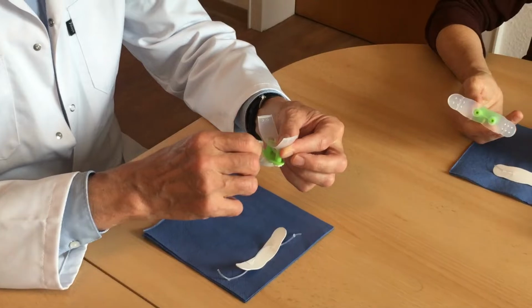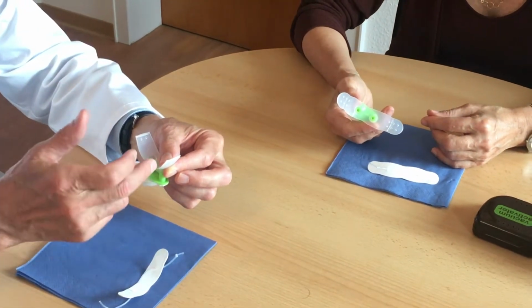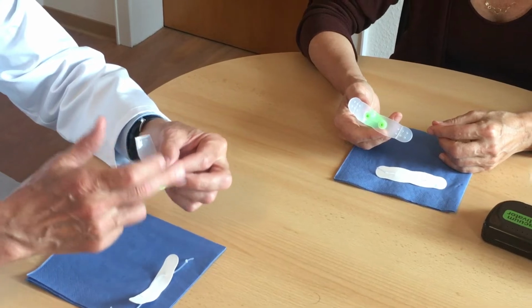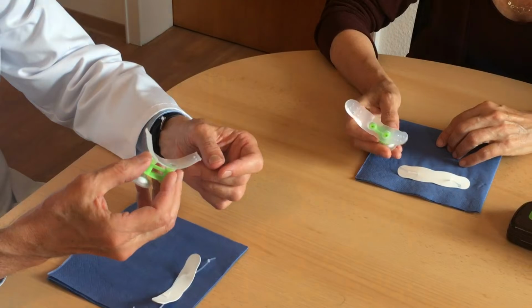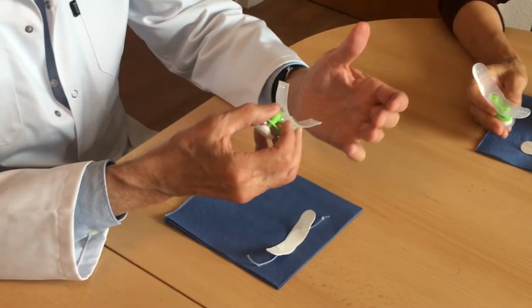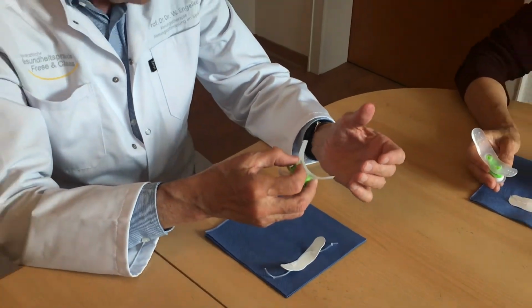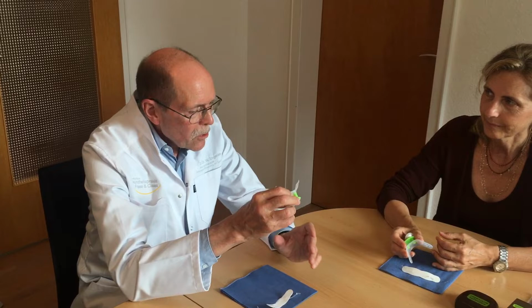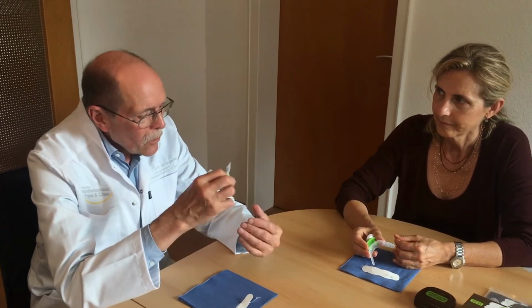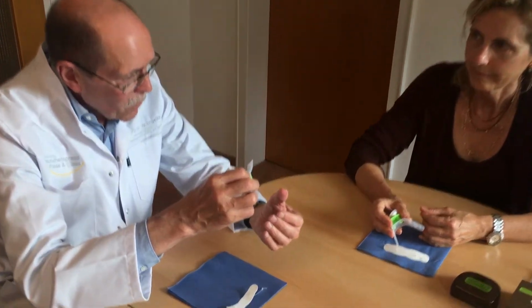This depends on the anatomy. The majority of people use the shortened form. If the shortened membrane is used, the production of saliva is significantly reduced. So we may use the vacuum activator to show if the Frankel space exhibits negative pressure.